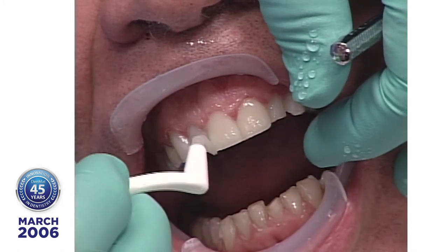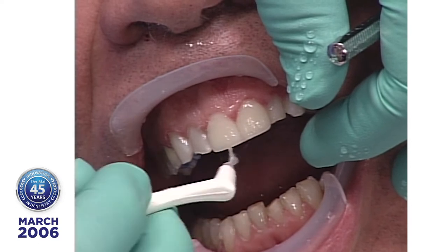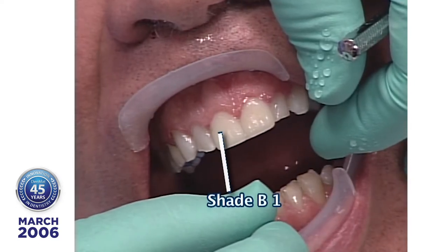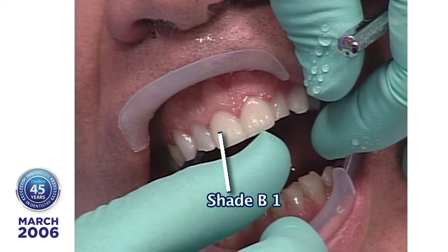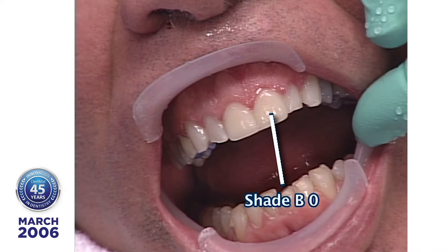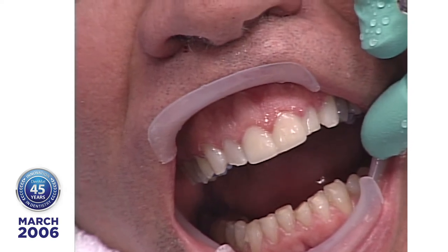The secret of a good Lumineer dentist is to have the ability to finish. Now, what we have on the right side is B1, and on the left is B0. So we're going to let our patient select the shade now. Here's a mirror for you.